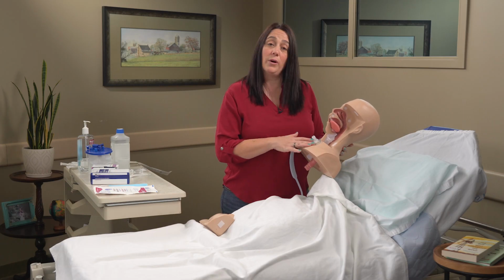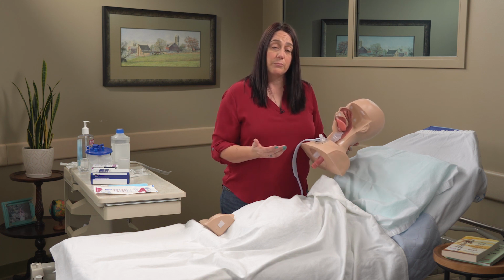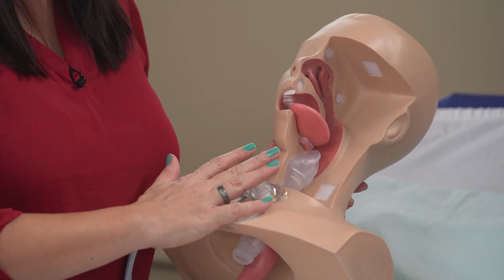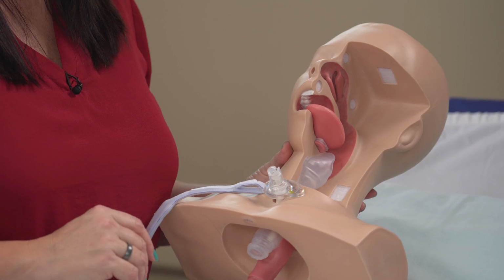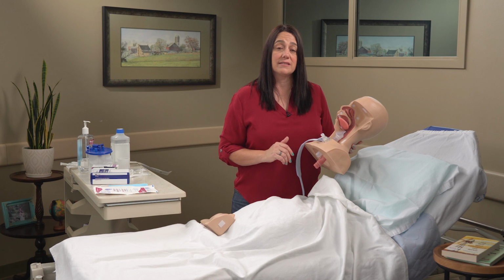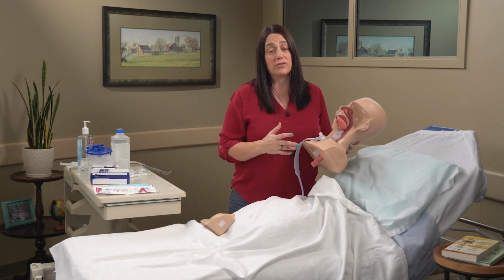So if the person looks like they're anxious, if they're looking at you like they need help, they're trying to cough and it's not working, get help. And then come and encourage that person to cough while you're waiting for the help to arrive. The other thing to know about the tracheostomy is that if you're moving that tube around, that can be uncomfortable for that person. So you always want to be careful when you're helping them with daily cares to make sure that you're not bumping that unnecessarily and causing that person discomfort. It's normal for that person, whenever the nurse is doing cares on that site, for that person to cough because it is going to irritate that person's site.